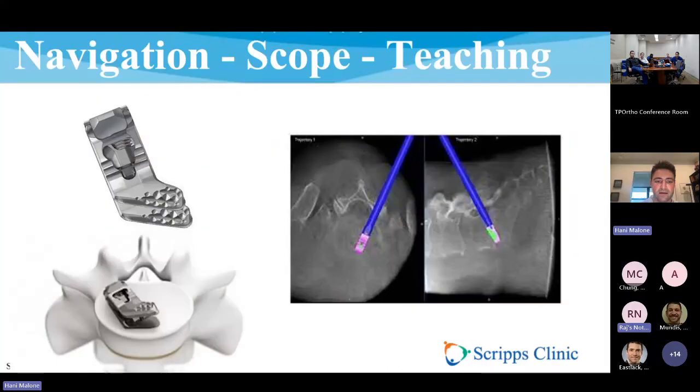And this is just a graphic showing that technique that I employed before. I like using this implant for two reasons. This is the one we used on Friday. The main reason is that I can navigate the whole procedure, and especially when I'm teaching you guys, having the microscope is super helpful, so I can see what you're doing. And if you're going to have the microscope in place, then it's hard to use fluoroscopy.